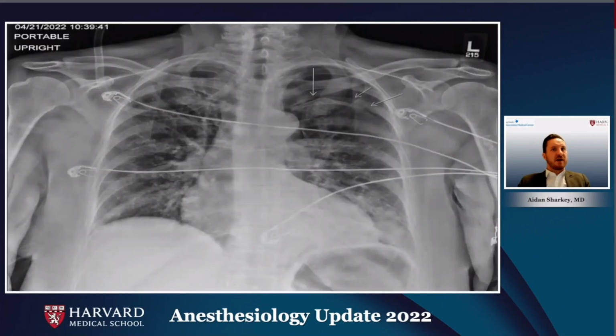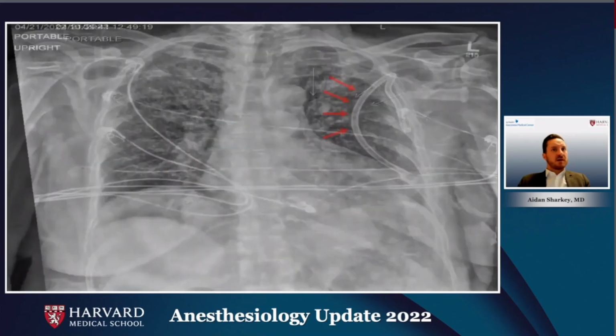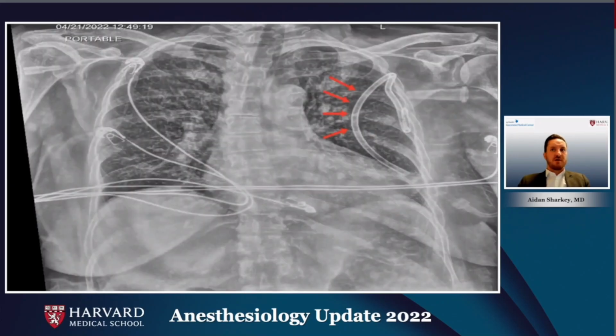So a chest X-ray was performed to ascertain whether she required an intervention. The chest X-ray confirmed a moderately sized left pneumothorax that was clinically significant, and so subsequently, this patient had a chest drain inserted in the PACU and had a good re-expansion of her lung, and her oxygenation and dyspnea improved. This case highlights the utility of lung ultrasound in the diagnosis of pneumothorax.